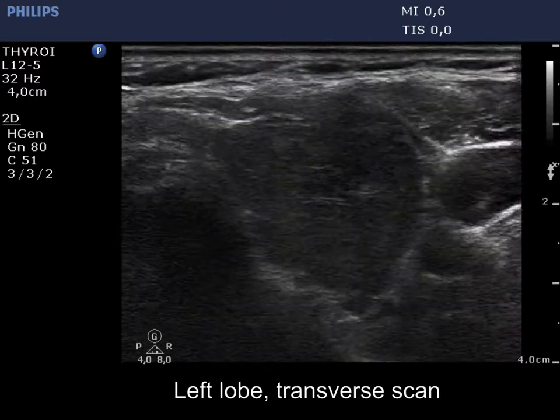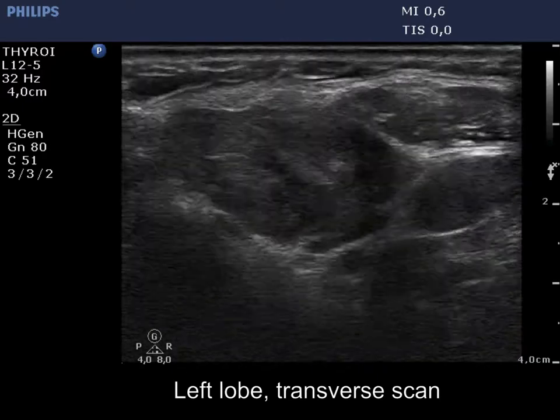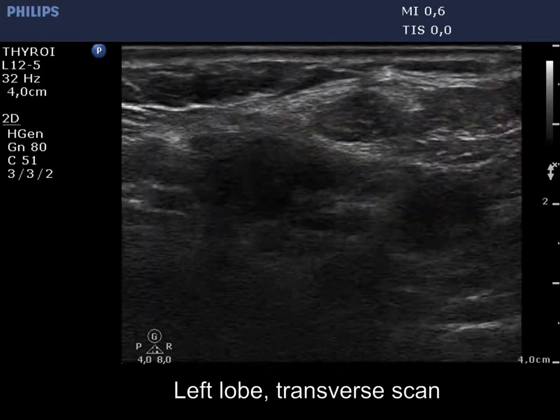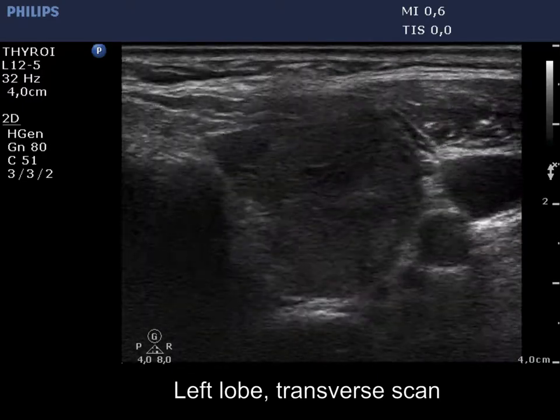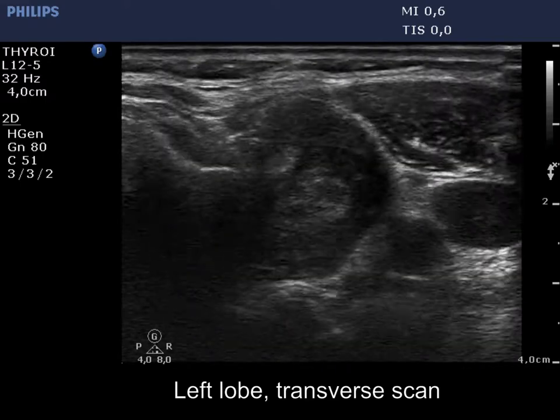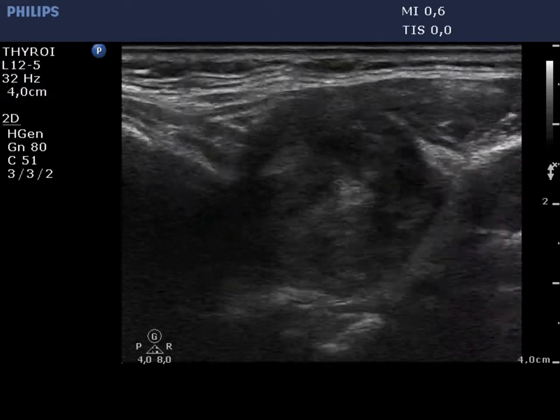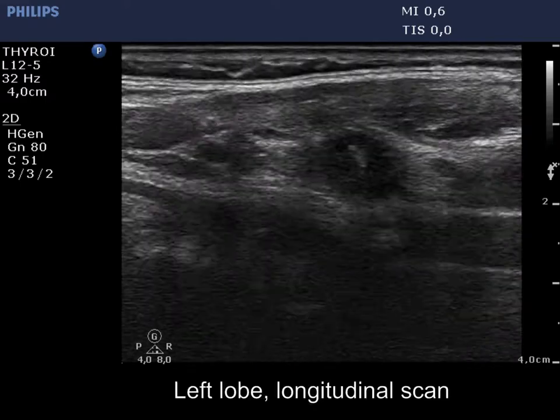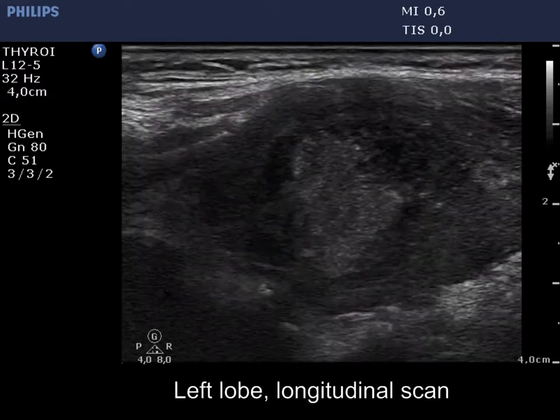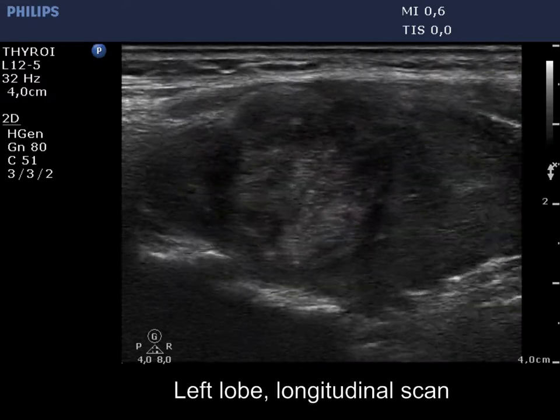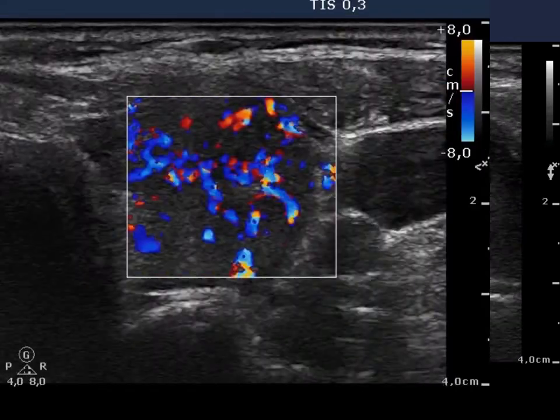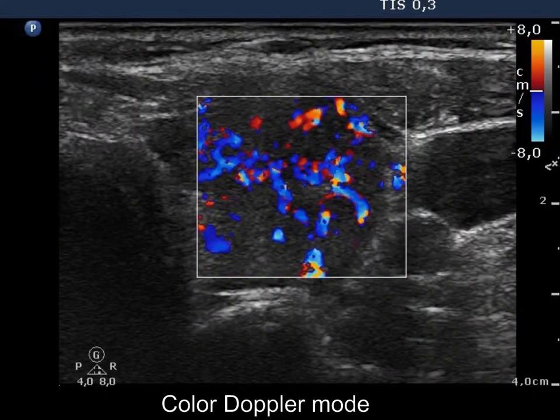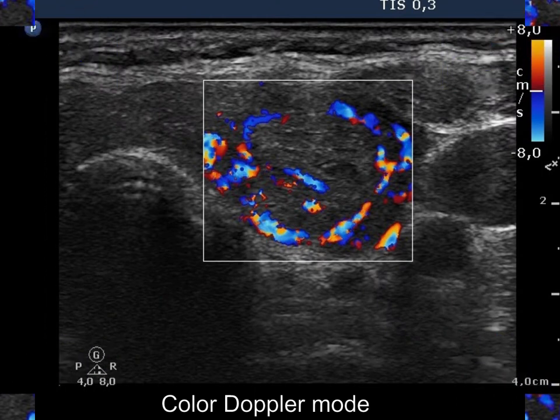There are two hypoechoic lesions in the left lobe, one in the lower and one in the middle part of the lobe. The extranodular part of this lobe is also hypoechoic and displays increased vascularization. The nodule presents paranodular blood flow.